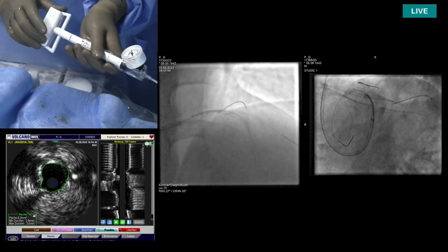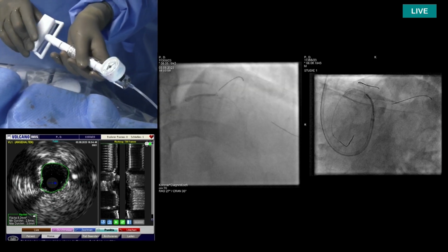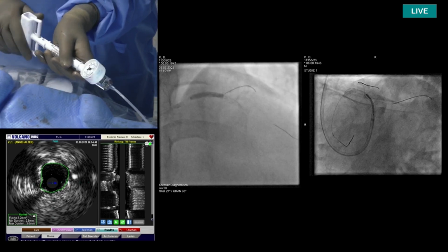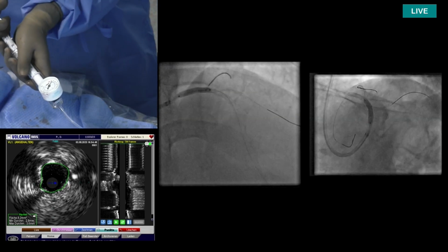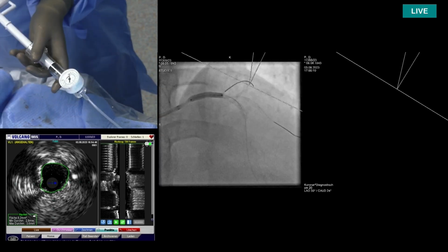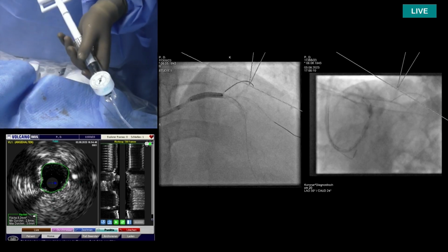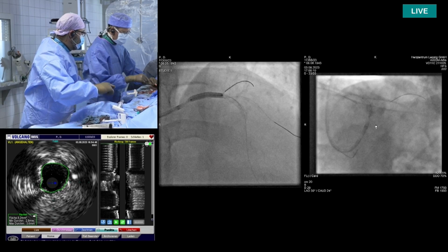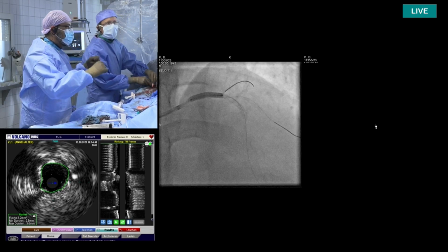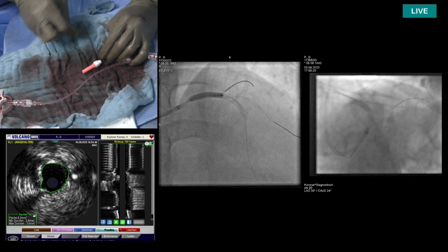So the stent conforms very well if overexpanded. The 3.5 overexpanded up to 6 millimeters is still going to cover the vessel well. And it has a lot more radial force and a lot more axial force than other stents in the market. So it's been widely used for proximal lesions, left main lesions, etc. I'm going to have it available very soon here in Brazil, I heard.